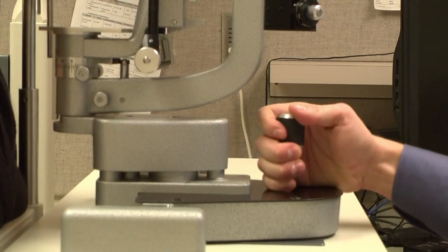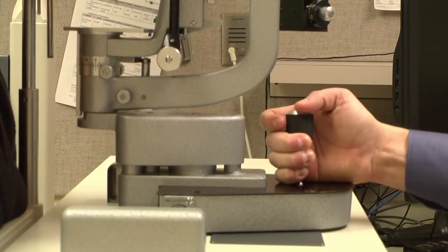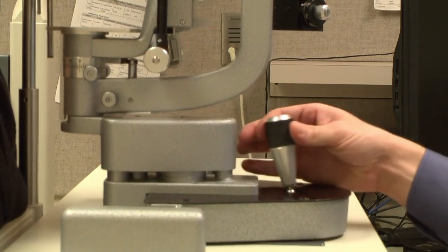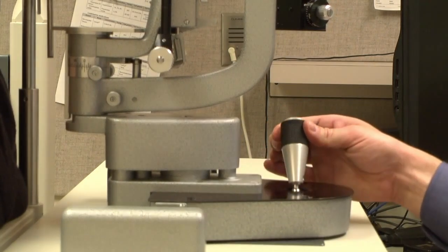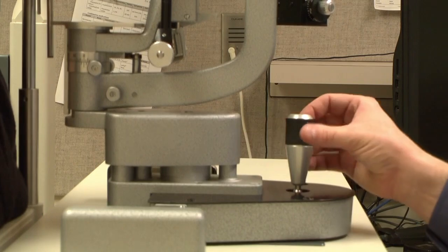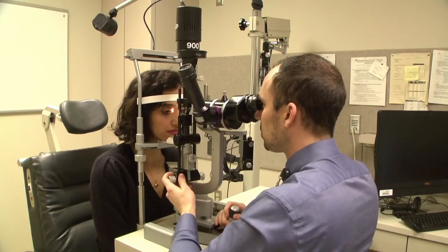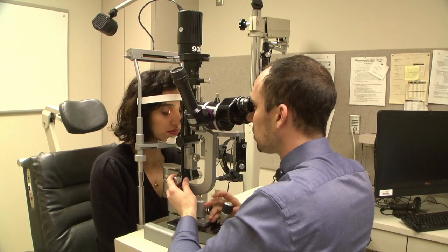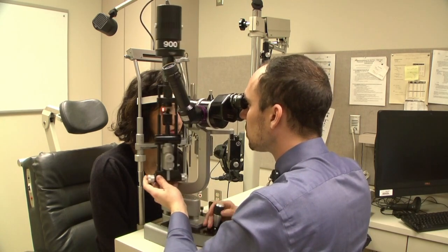Perform gross movements by moving the base of the joystick with the bottom of your hand. Perform fine movements by moving the top of the joystick with your thumb and forefinger. Rotate the joystick clockwise to raise the beam. Rotate counterclockwise to lower the beam. Good technique is to have one hand move the illuminating arm and one hand moving the joystick.